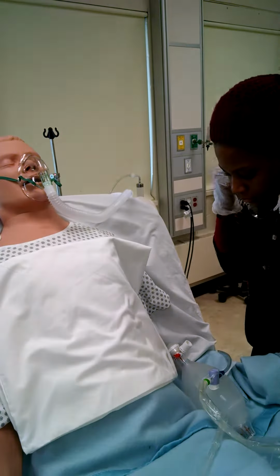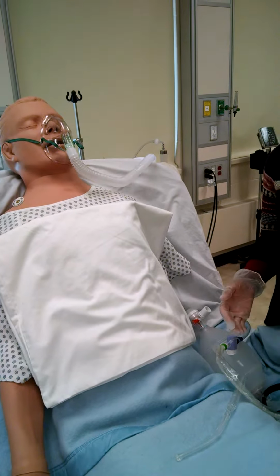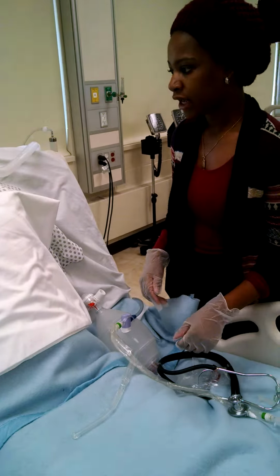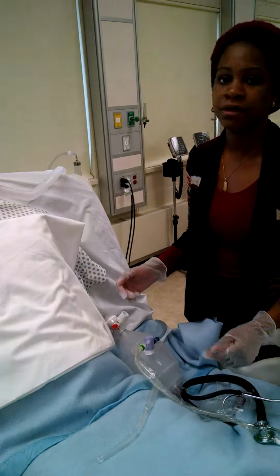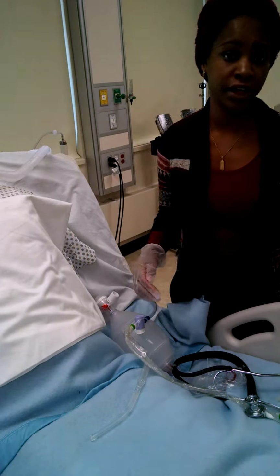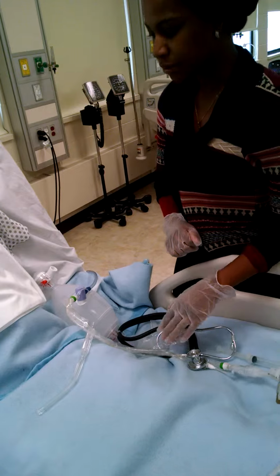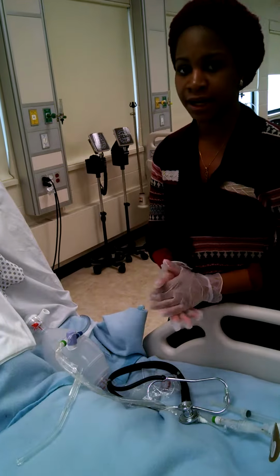Okay, great. I would check the patient's pulse ox saturation once again, his heart rate and his respiratory rate all once again. And if he did have stridor, if it was severe, there's mild, moderate, and severe. If it was severe, I would go ahead and re-intubate the patient right away. Okay, so at this point I will go ahead and wash my hands once again.